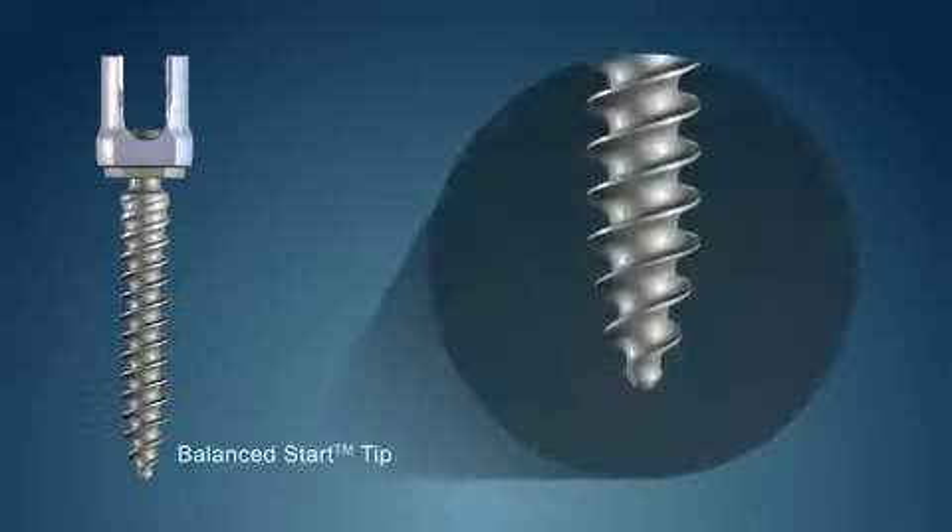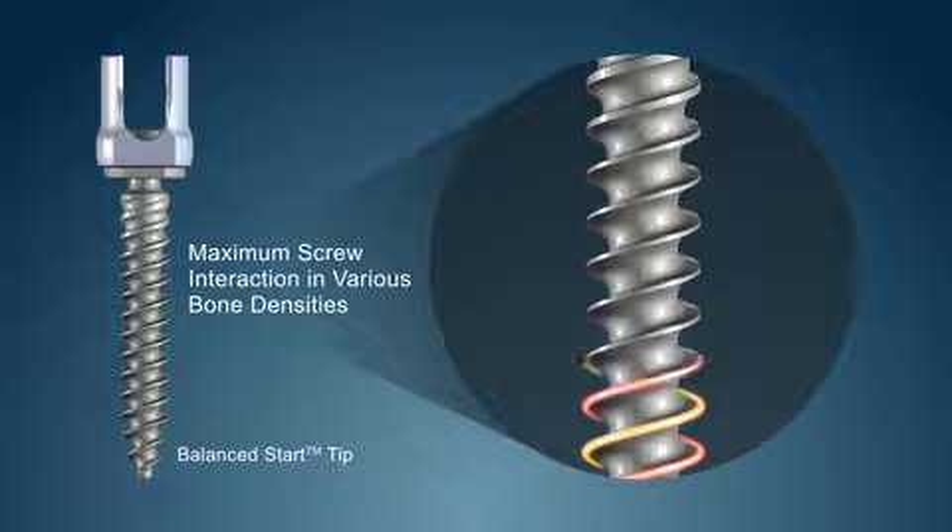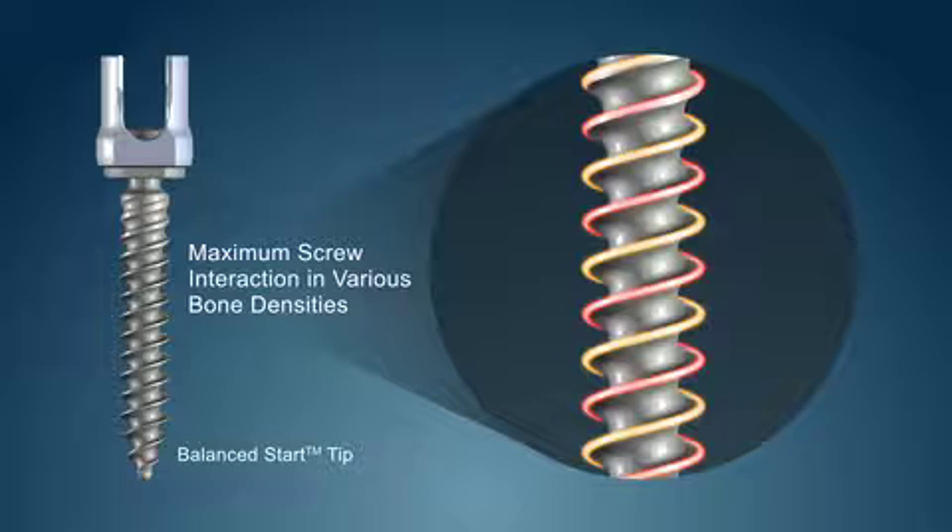The unique balanced start tip geometry minimizes toggle during insertion, provides accurate placement and screw trajectory. The thread profile maximizes the screw interaction of various bone densities.